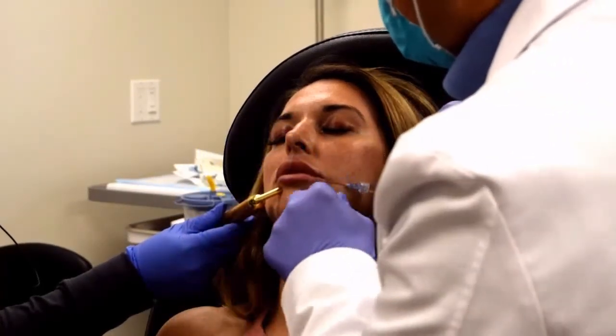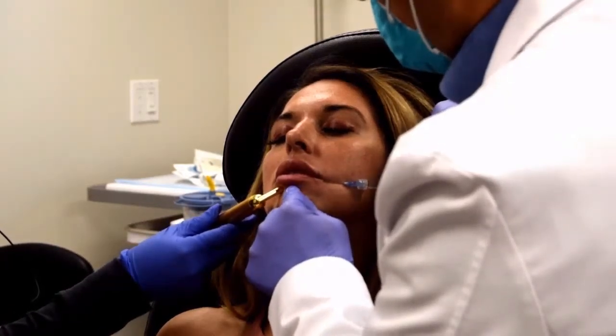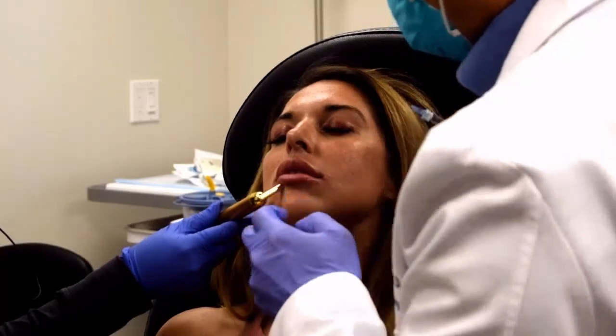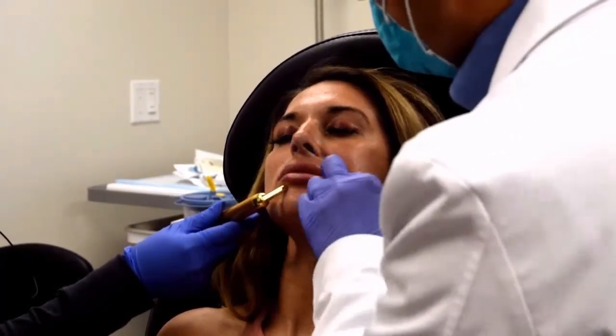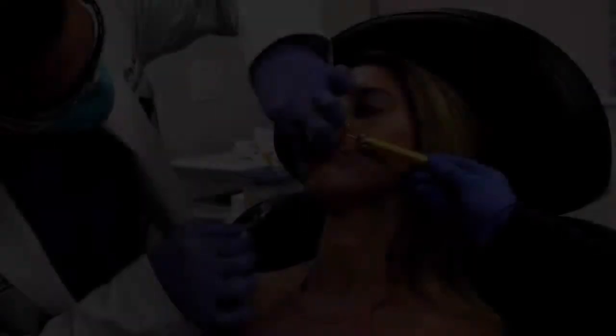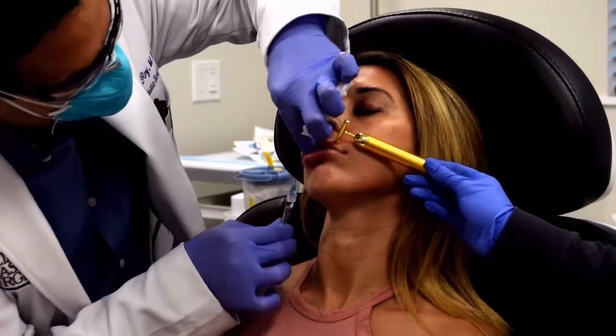Not in individual blebs or boluses like people used to previously do. People are still doing that, but I really like this technique. I think that it results in less swelling, less bruising, and fewer pokes and needles for the patient.